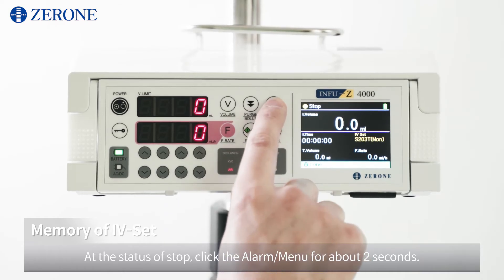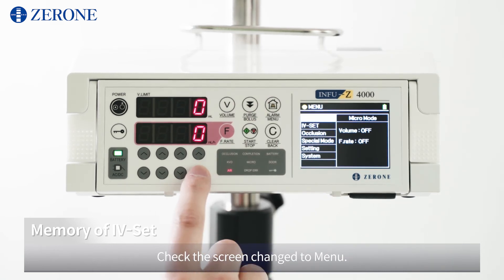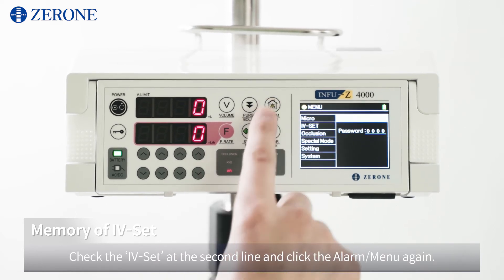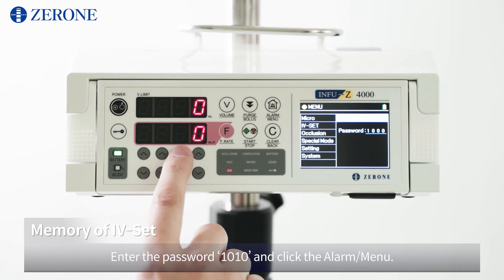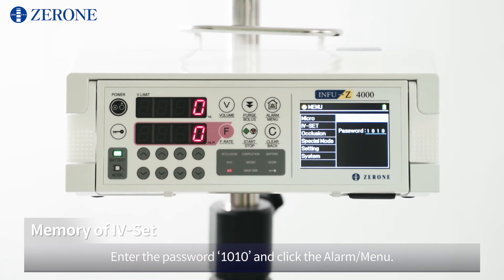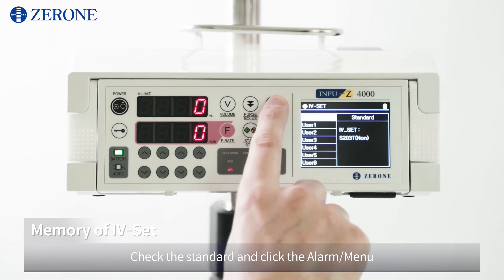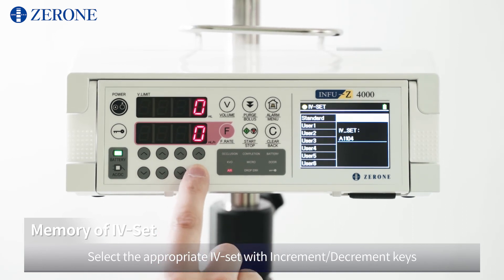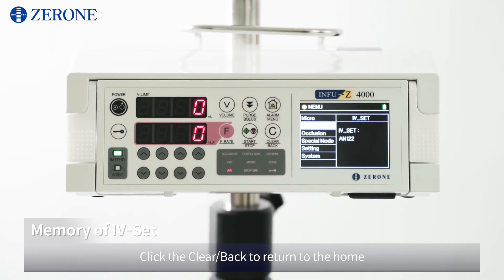At the status of stop, click the alarm/menu for about 2 seconds. Check the screen has changed to menu. Check the IV set at the second line and click the alarm/menu again. Enter the password 1010 and click the alarm/menu. Check the standard and click the alarm/menu. Select the appropriate IV set with increment/decrement keys and click the alarm/menu to complete it. Click clear/back to return to home.